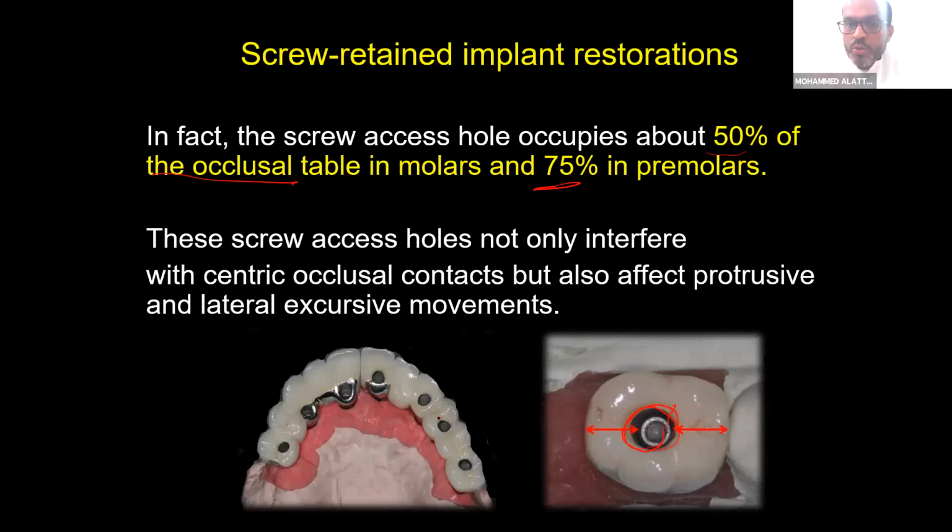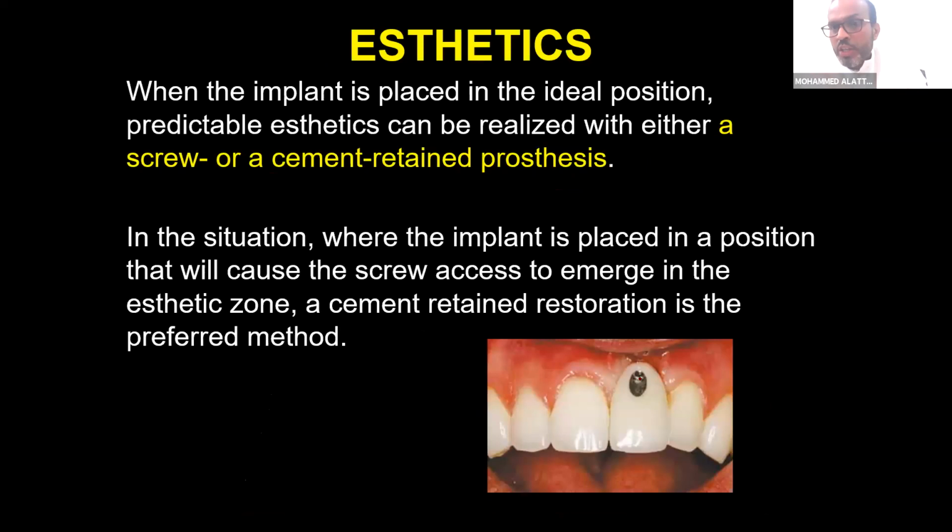For that reason, we like to do screw retained, but there are also some drawbacks to the screw retained. And also for the aesthetic cases where the implant is not placed in a good position, you will end up with a labial position of the screw access.